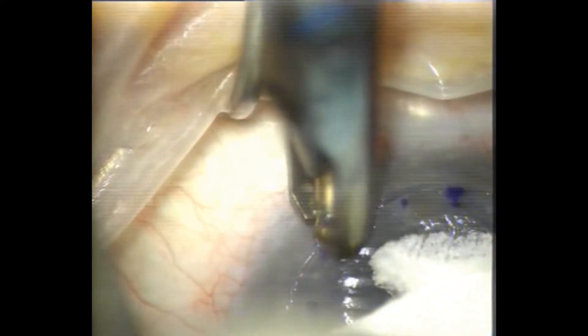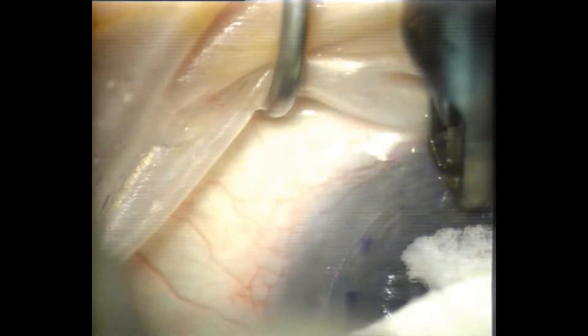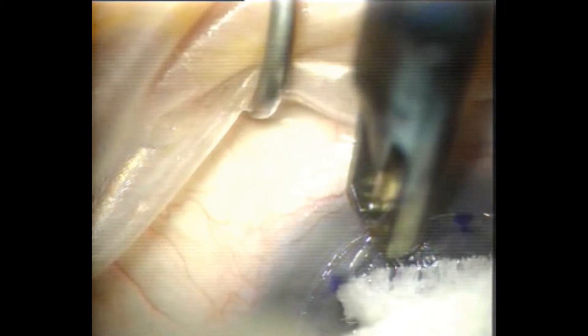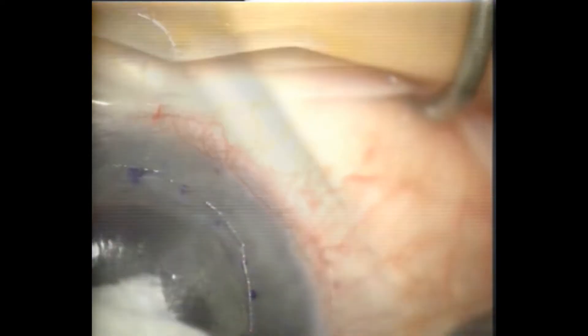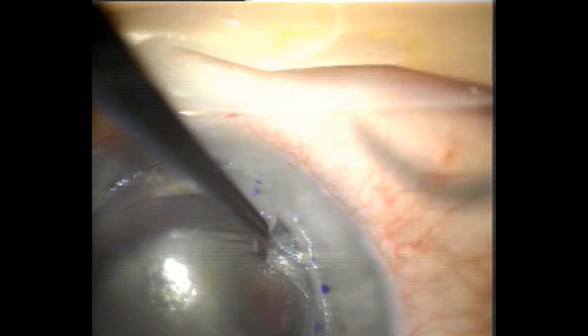I've got a little bit of tram tracking there and I need to join up those two incisions with that cut. Now to remove the tissue between the cut and the graft-host junction.